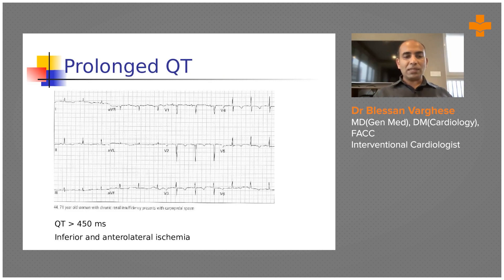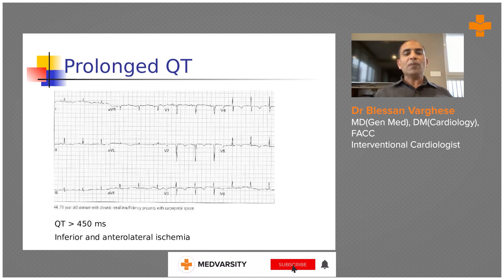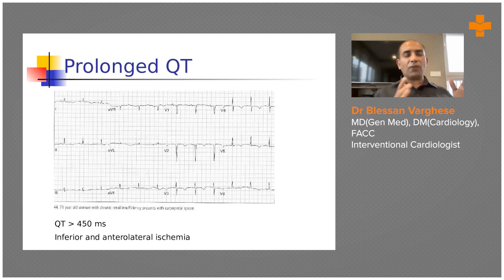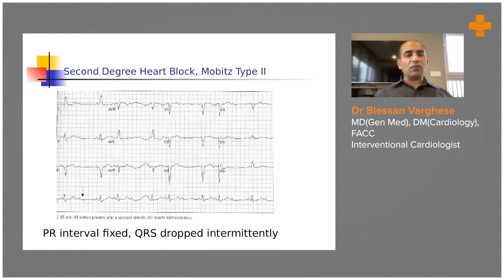There are many criteria to diagnose ventricular tachycardia, but this ECG demonstrates prolonged QT. A simple way to identify QT prolongation: if the T wave ends beyond the halfway point between two consecutive R waves, the QT is prolonged. To calculate the exact corrected QT value you need Bazett's formula, but visually, if the T wave crosses the midpoint of the RR interval, QT prolongation is present. Any QT prolongation must be evaluated for ischemia or drug effects.